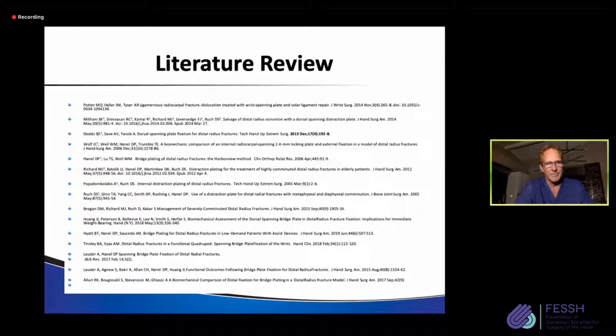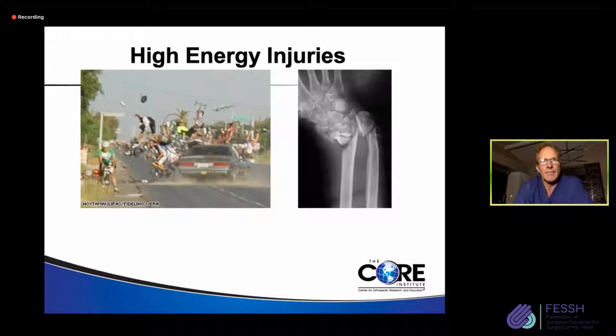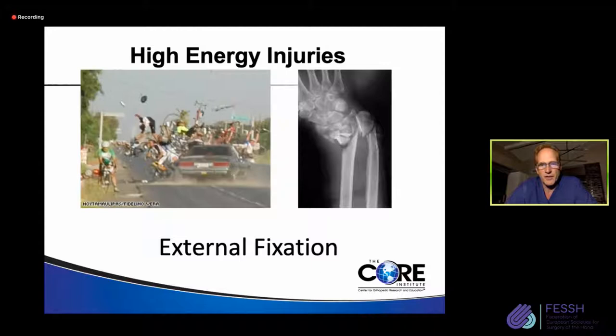It initially began as a result of a situation dealing with high energy injuries to the distal radius, these highly comminuted intra-articular fractures, sometimes open, with a lot of soft tissue injury. Well, usually these were fixed with external fixation. And I think a lot of you still would address this fracture perhaps the same way.